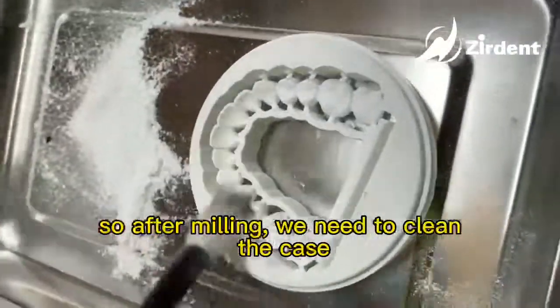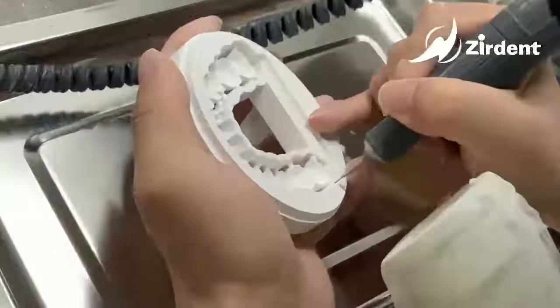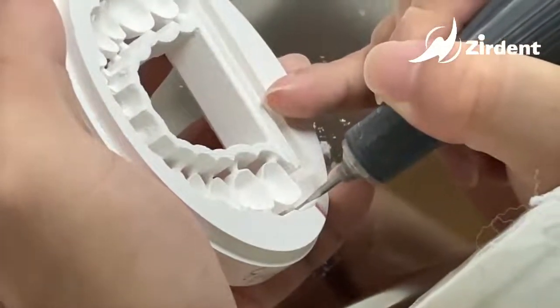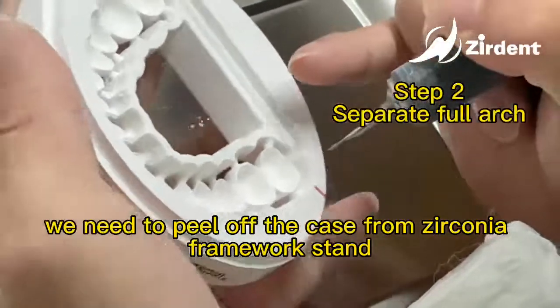So after milling, we need to clean the case. We need to peel off the case from the zirconia framework stand.